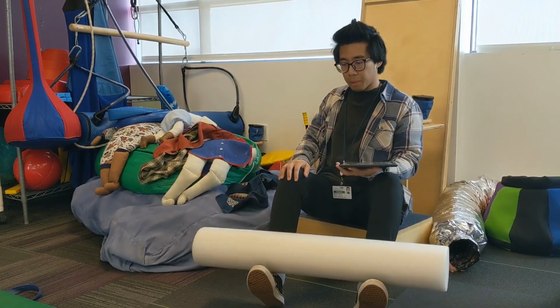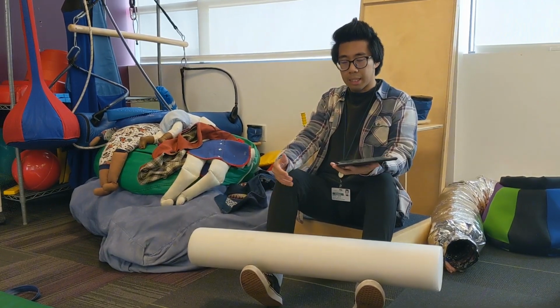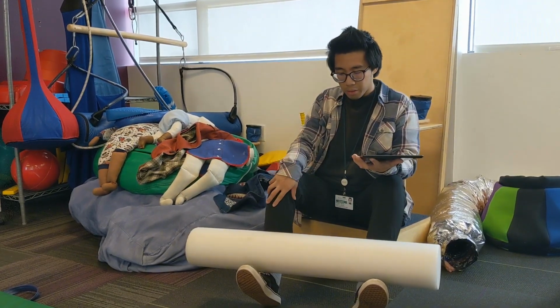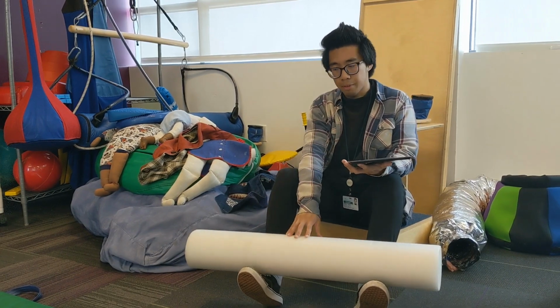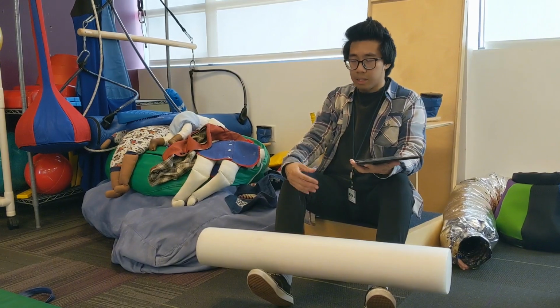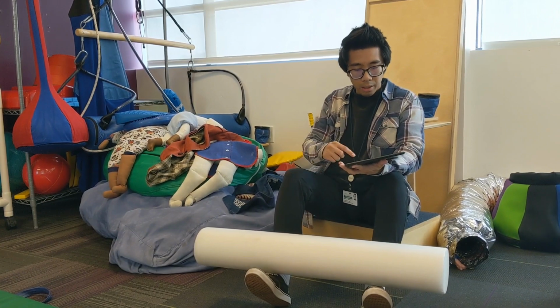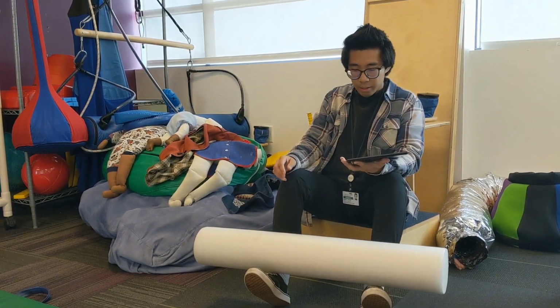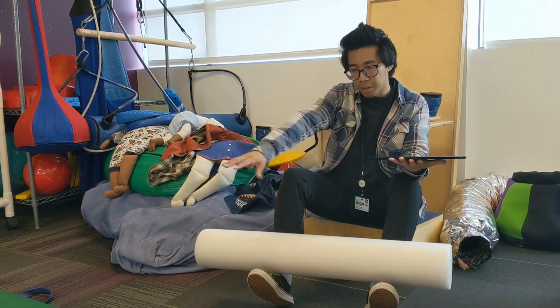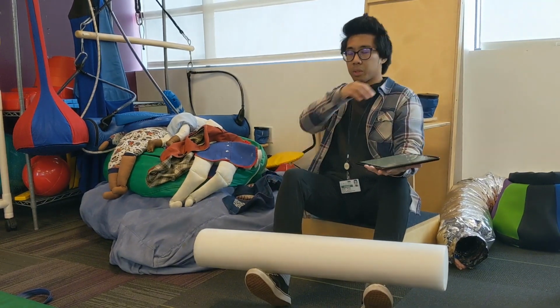For the second piece of equipment, I'm going to be using a bolster to once again address his low tone, his decreased trunk stability, and his inability to sit up independently. I want to address low tone by providing that vestibular and proprioceptive input by rolling Raj on his belly. Once again, have him understand his environment by adjusting his body and promoting that muscle coactivation. To address that decreased trunk stability, he's going to be placed on his belly. The goal is to have him reach for certain toys that are in various directions, or he can reach above to promote those extensors in the back.